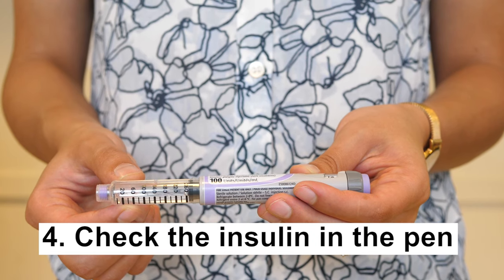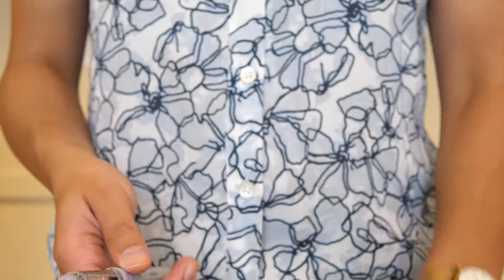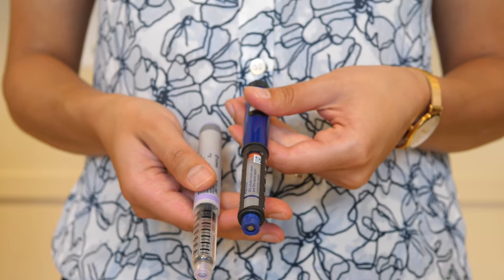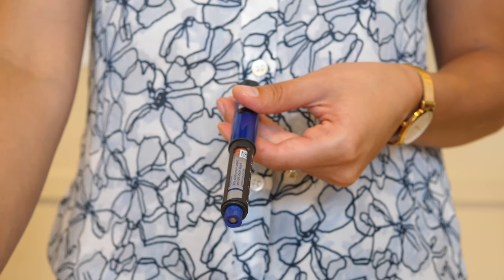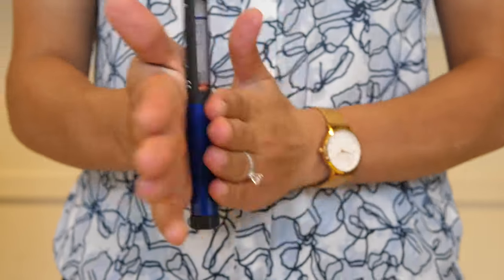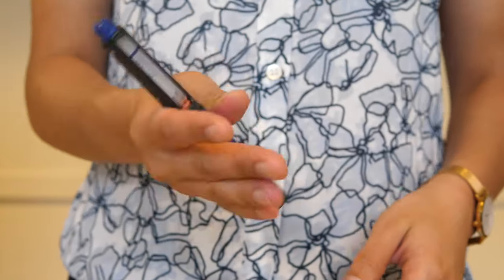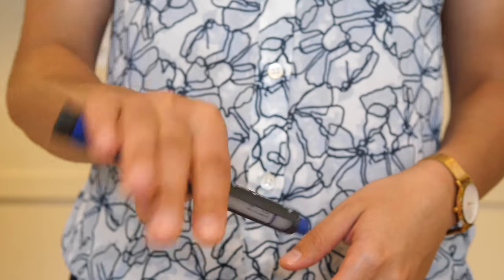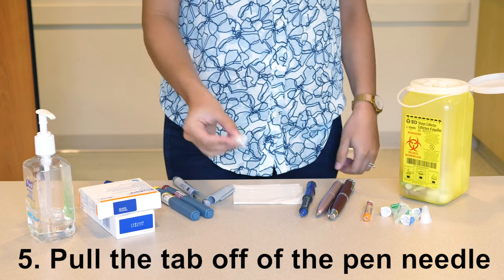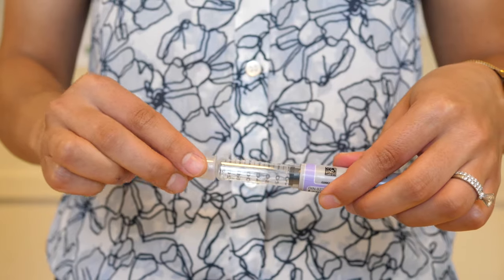Check the insulin in the pen. The insulin in the pen or cartridge may be cloudy or clear. If it is a cloudy insulin, there are two types of insulin in the pen. The insulin must be mixed so that you get the right amount of each insulin. To mix the insulin, roll the pen between your palms ten times, then tip the pen ten times. This should be done before every injection. Pull the tab off the pen needle and attach it to the pen by twisting the needle clockwise until it is tight.